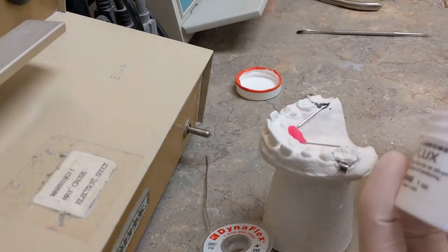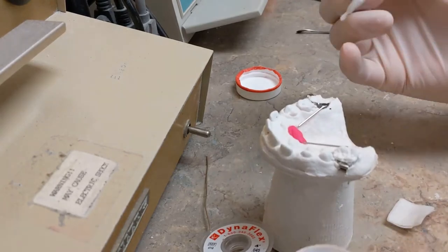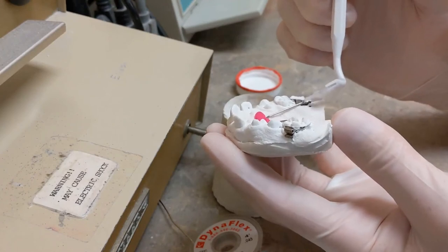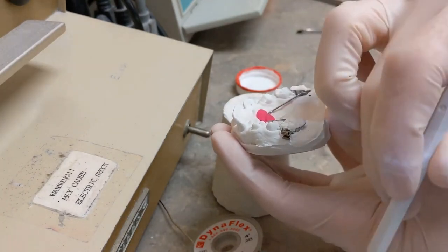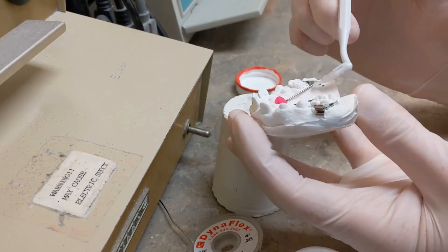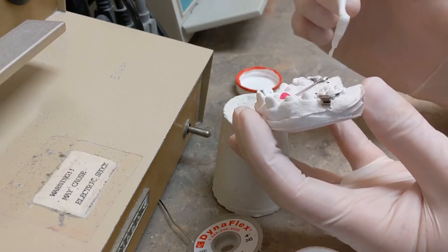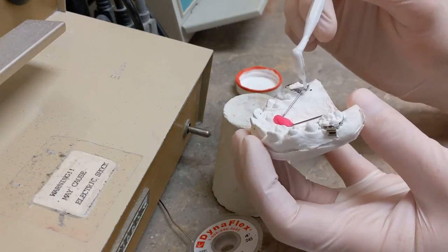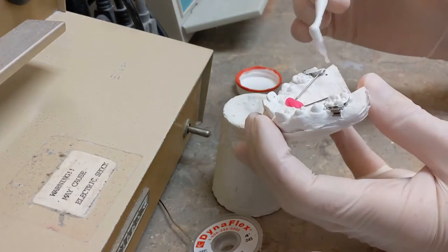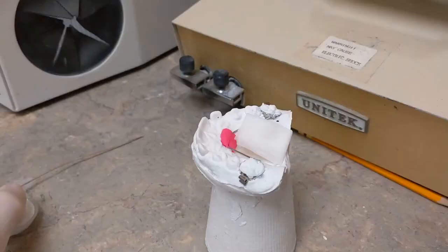Before you solder, apply the flux. Take the flux on the little brush and put flux wherever you want solder to stick — just paint it on. You don't want to gob it on crazy heavy, but make sure there's flux everywhere you want that solder to stick. What flux does is help clean off the surface of the metal and help the solder stick. You want it all along the side of the band and on the wire so the two get bonded together with the solder. Apply that to both sides.